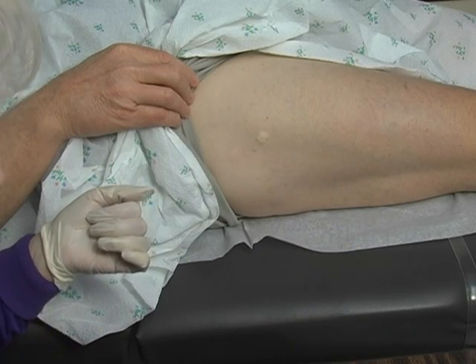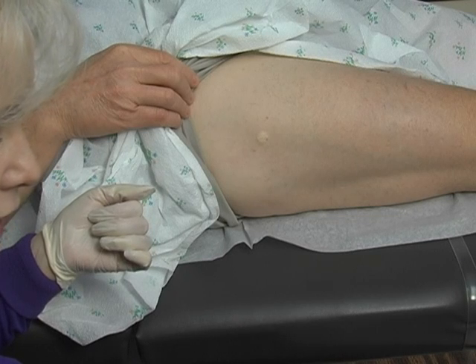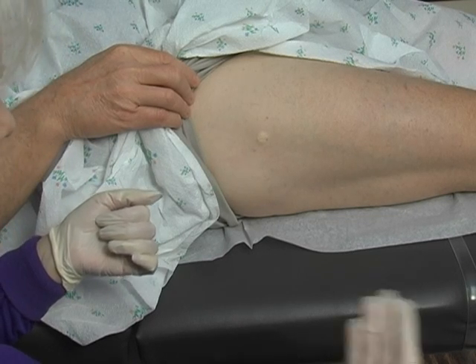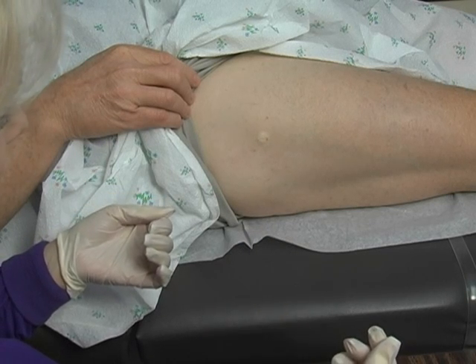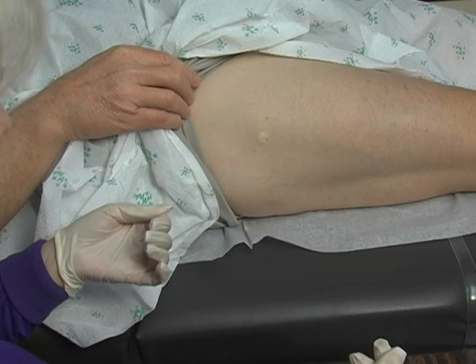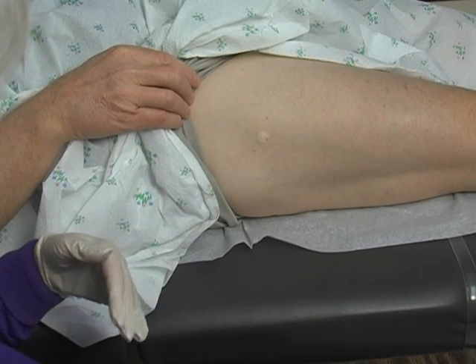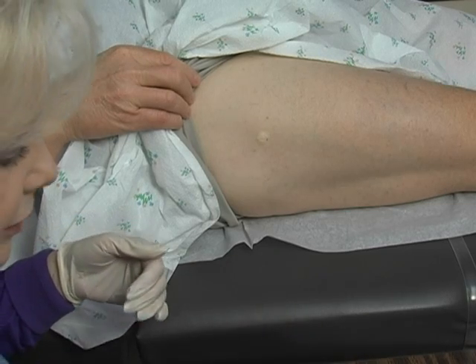I'm going to be very careful to set my lidocaine needle back down without actually capping it. You'll see our challenge in getting this sticky little specimen into our zamboni fixative — it tends to stick to your forceps. So Lynn likes to use the needle itself to scrape that specimen off.